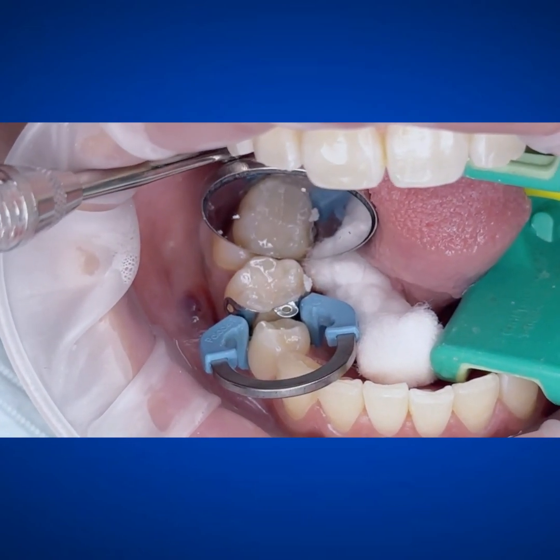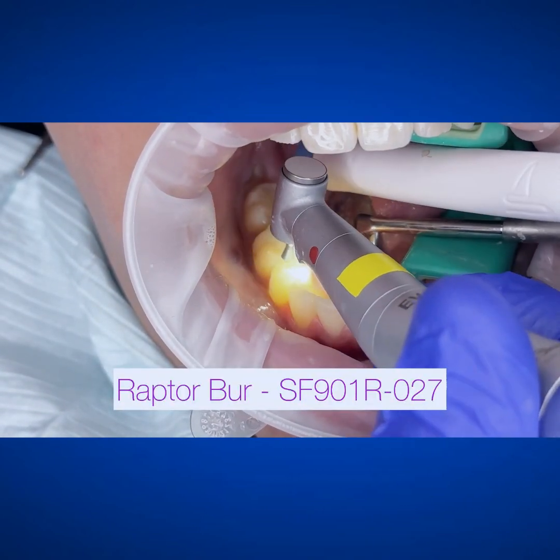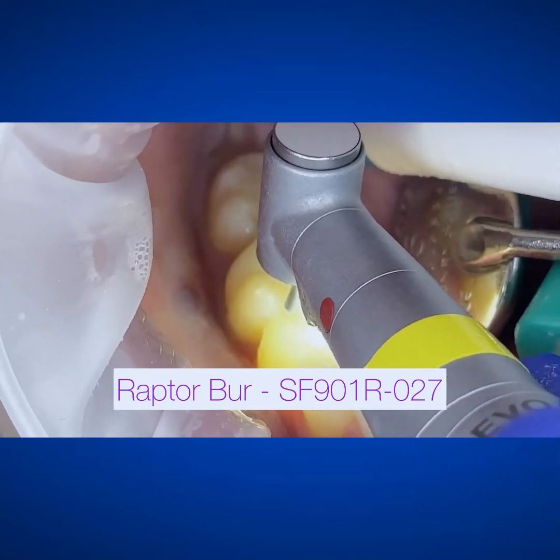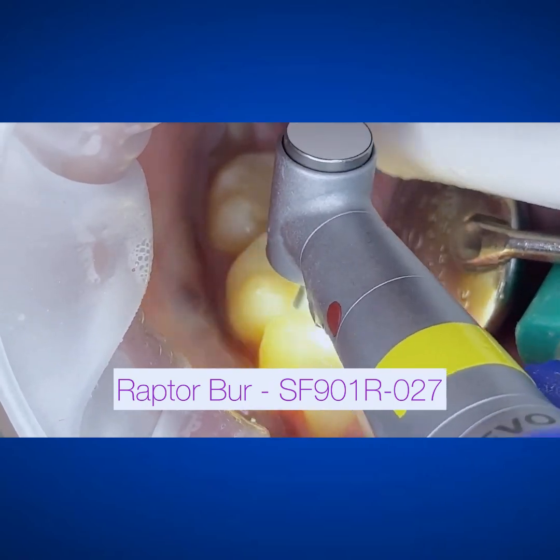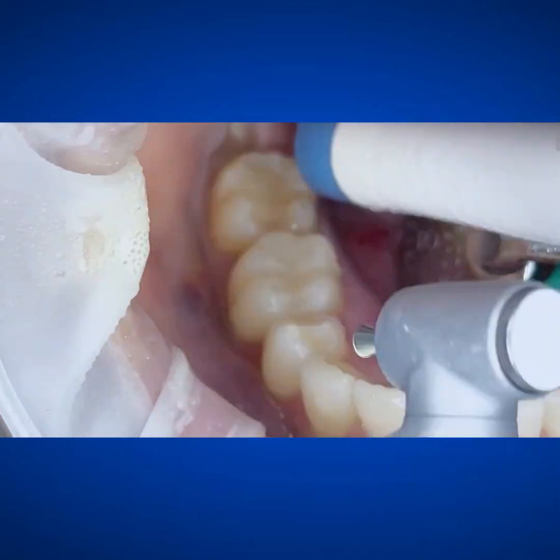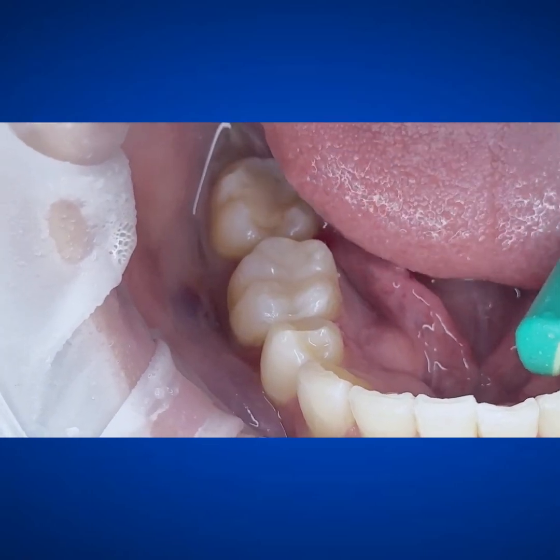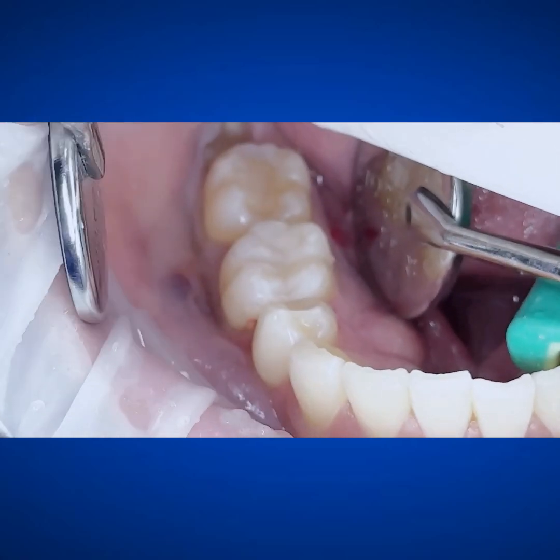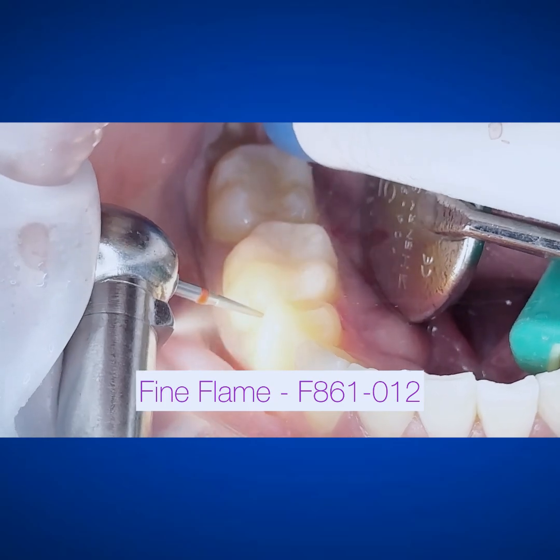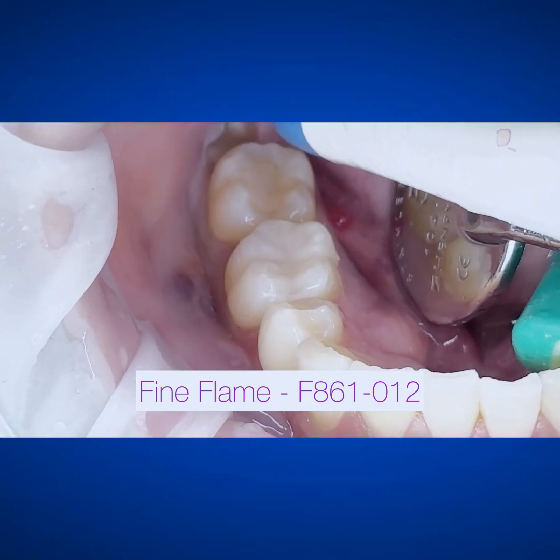So now once I'm in this general look, I'll take that ring off, and then there's that Raptor bur I was talking about. This is my workhorse for shaping the occlusals, any sort of anatomy. I'll take it right back over the marginal ridge and approximately between the two teeth because it matches that acorn condenser, and it's already looking just like a regular tooth. Then I'll get in there with that flame bur — I'm using a fine flame just to get in between and trim that box, get it all nice and clean and flush.